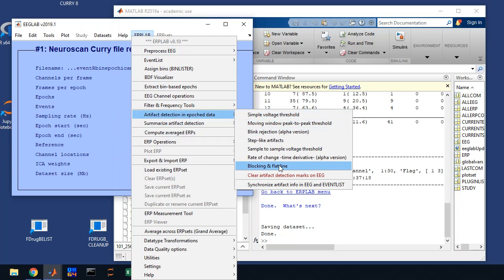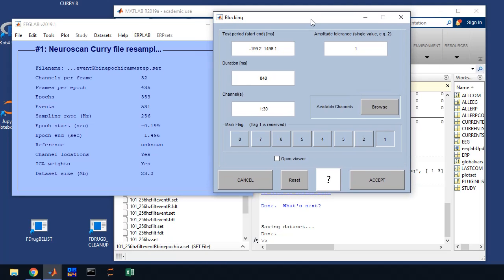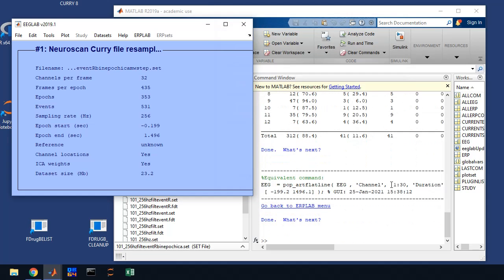Then the last one, we're going to click blocking flatline. This detects flat lines in your ERP data set that can happen if you have a dead channel or if it goes out of range. It's not much of a problem with our Neuroscan amplifier. We have a huge range, but we sometimes might have a flat or dead channel, in which case we want to detect that and maybe examine it a little bit further. So this is our third algorithm. So we're going to click four, check the values in here, click accept.